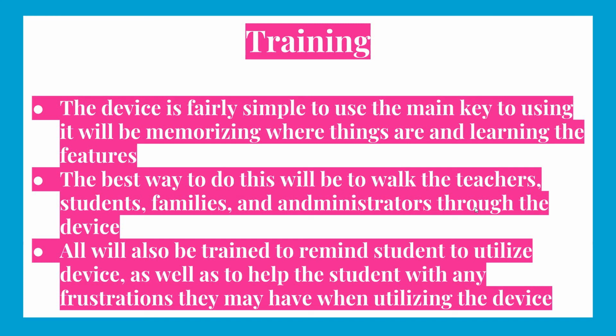Now, for training, I feel like the device is fairly simple to use. The main key to using it will be just memorizing where things are and learning the features. So, learning maybe different codes or layers or learning where everything is. So, you know, like when you move into a new house, you have to learn where you put everything and you have to set it up how you want. Like, that's going to be what the device is going to be like. So, I think it'll mainly just take time.